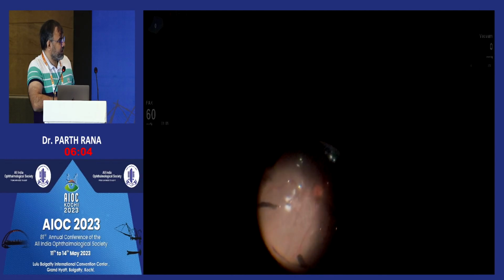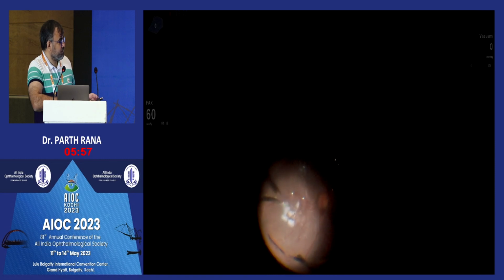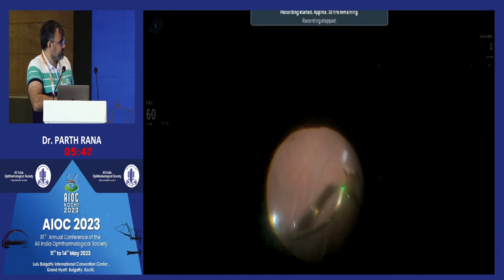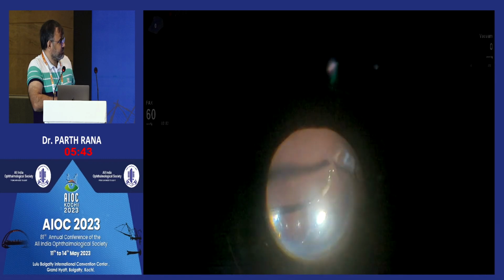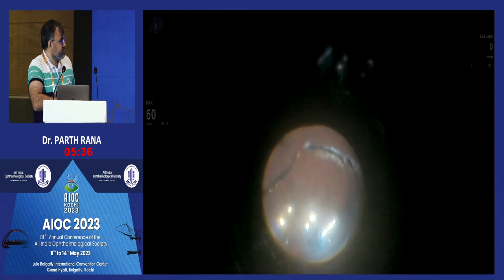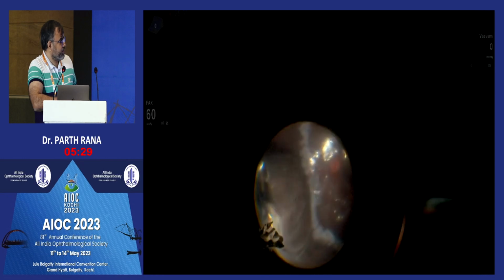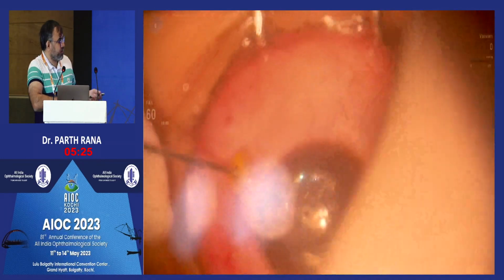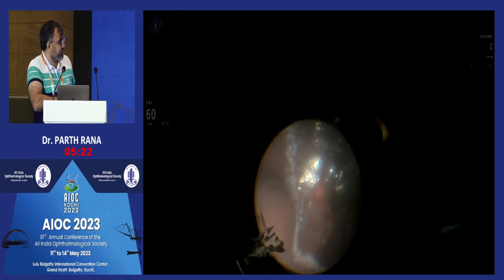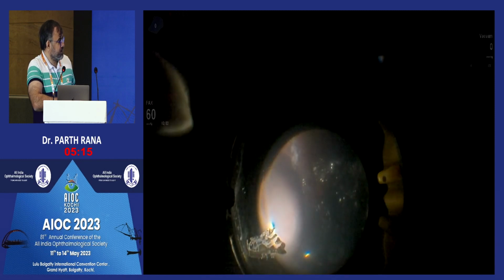I started doing laser, and I did almost 360-degree laser around the hole, as well as 360-degree laser was done. Almost when I completed laser, I felt that I should do cryo in periphery due to some of the retinal holes in periphery. I started doing cryo in periphery. Due to the phakic lens, I was not able to go with the laser.